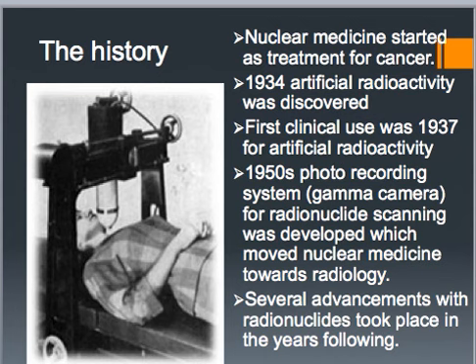In the 1950s, its use increased to measure the function of the thyroid and to diagnose thyroid disease, and also to treat patients with hyperthyroidism. So that's where it first started. Nuclear medicine mainly just focused on the thyroid in the very beginning. As you can see from this machine here, this was one of the very first nuclear medicine machines, and it's pointing directly at the patient's thyroid. That was its main purpose.